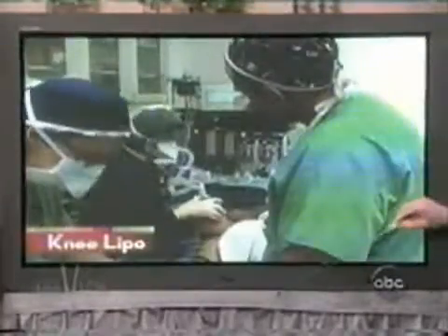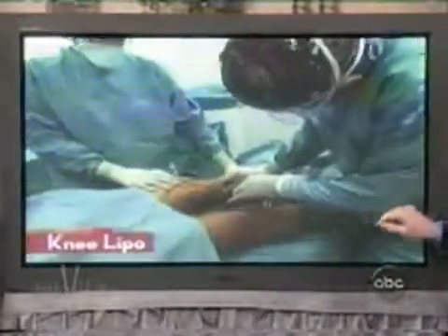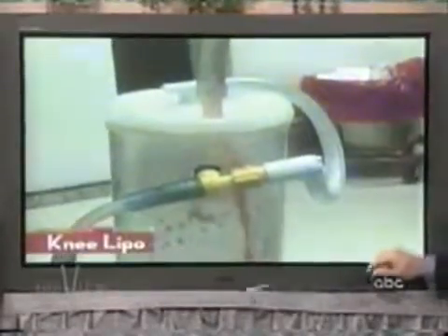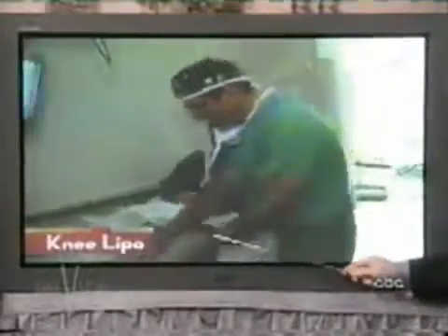There's also a bone in there. Again, she's having anesthesia, so she's out for this. The area's got an iodine prep to it. The liposuction is done with small instruments through small holes. And yes, at the end of the procedure, I can see the shape that I made, a better shape. And here she is, really 15 minutes later, smiling, and she's got wraps on her legs.